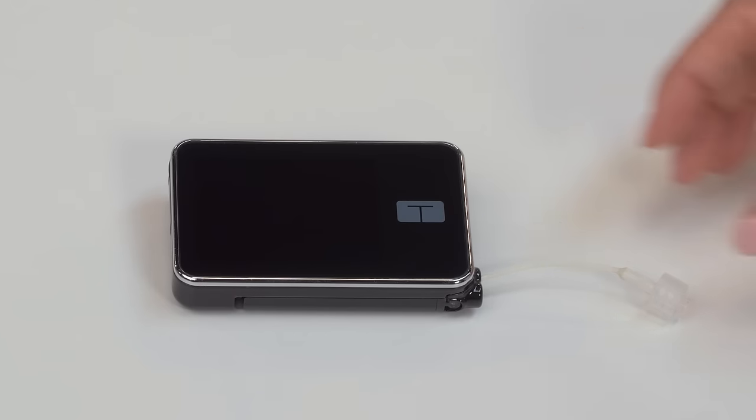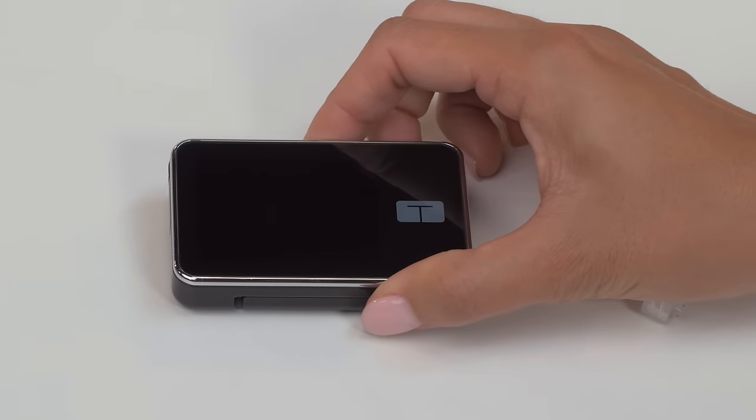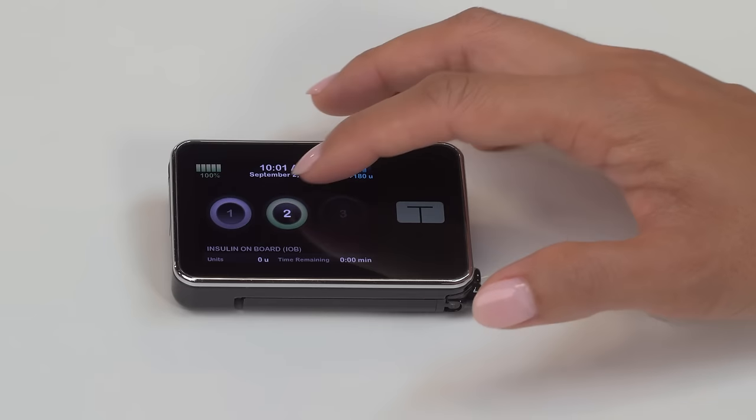If your pump screen times out at any point during the load process, just unlock your pump and it will resume right where you left off.